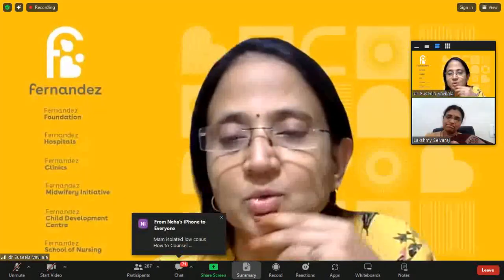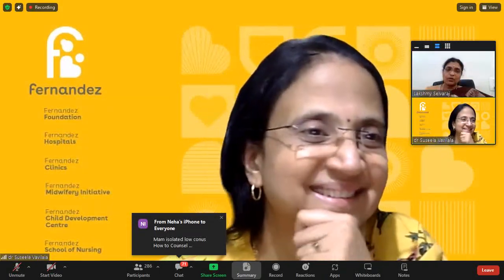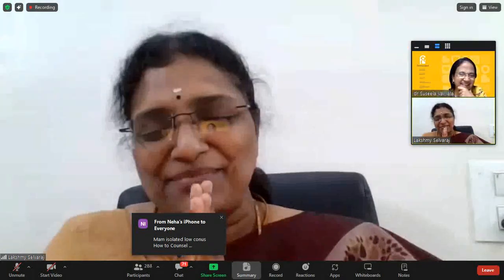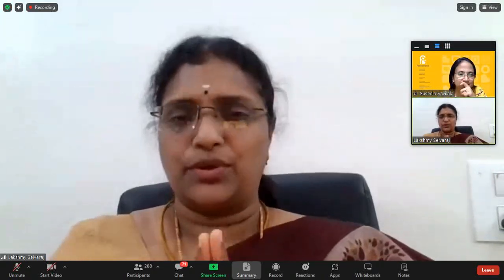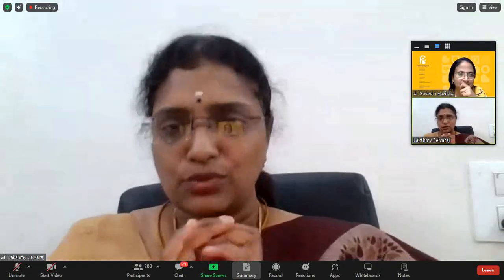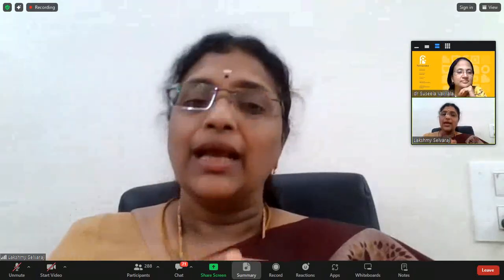Sure. So, what is your advice for radiologists doing only 2D scans? Oh my God! Please do not ask me that. As I told you, my last slide clearly said that the suspicion is on two-dimensional ultrasound. I said do not be carried away by fancy 3D images. It doesn't matter at all.